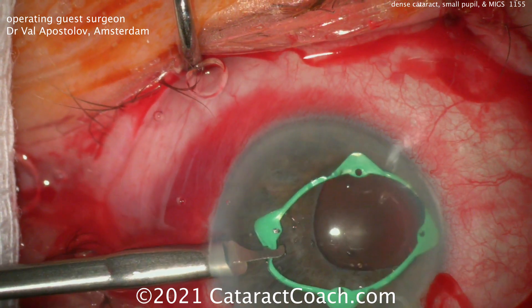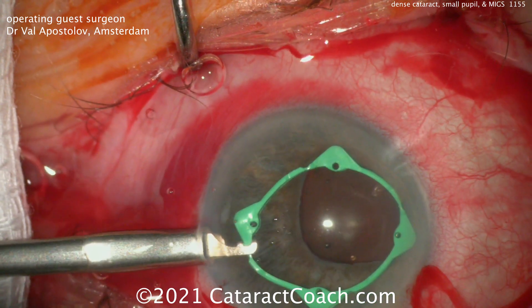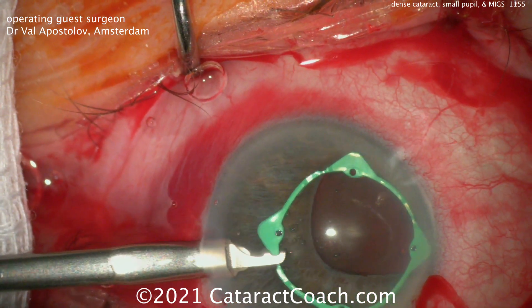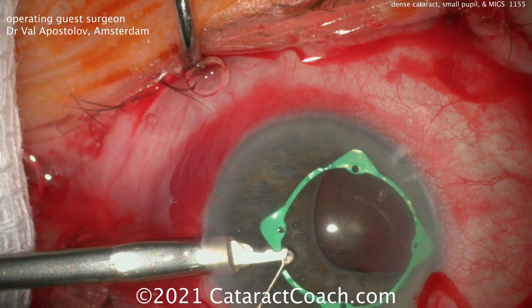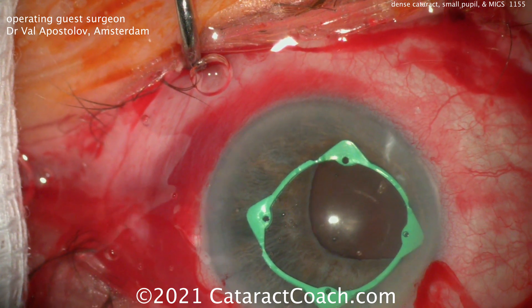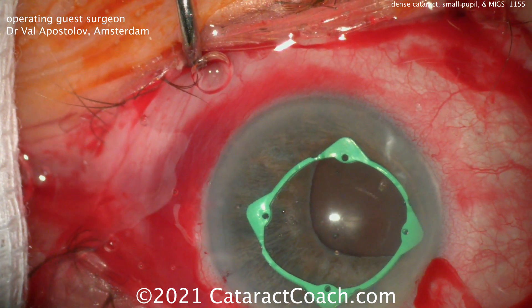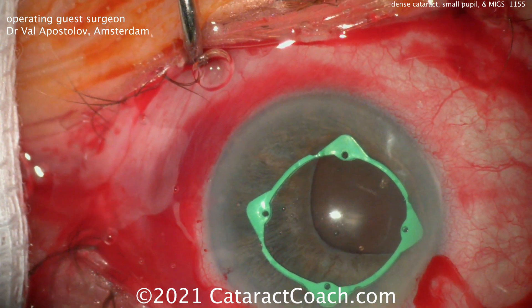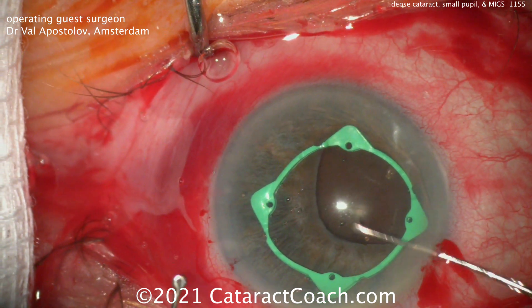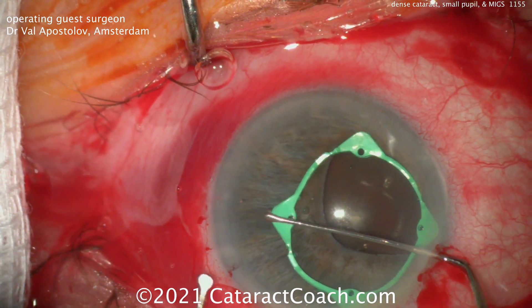There's one, there's two. Dr. Apostolov is slick — he's got two points on just with the injector device. And then the other two have to be hooked too. He's going to use a second hand. This patient has a small pupil. It looks even a little bit fibrotic, and it doesn't look like this is a very reactive iris either.